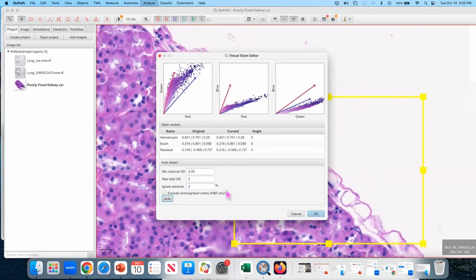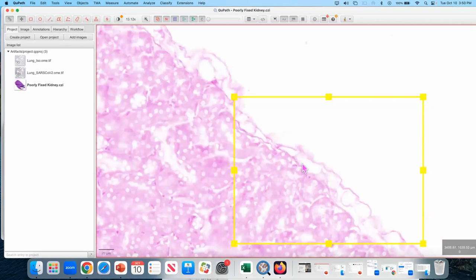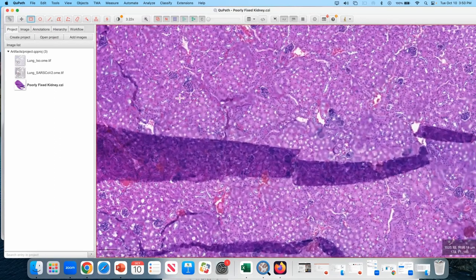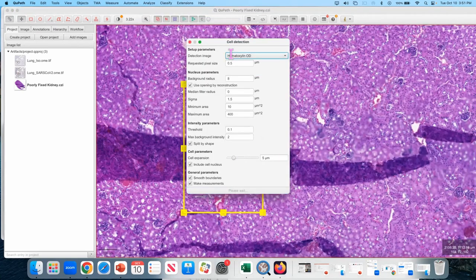Stain vectors. Make sure that they are reasonable, look good. And let's go ahead and try to make some detections. The default parameters.